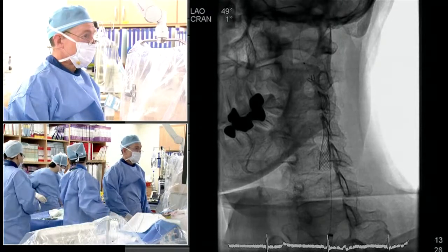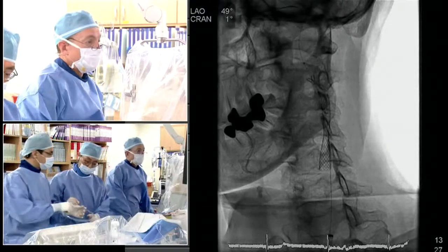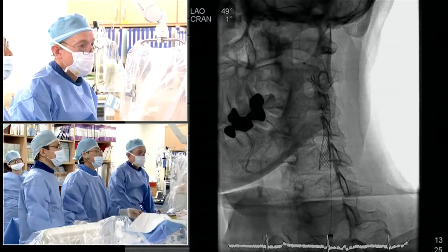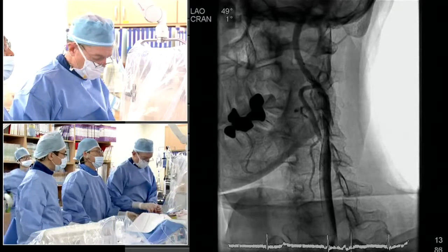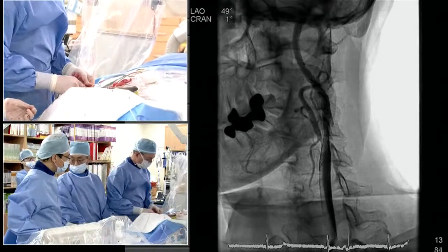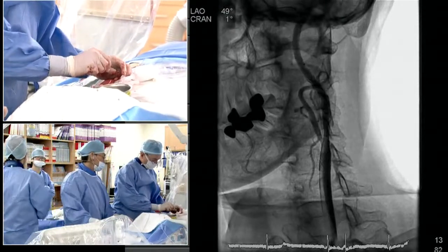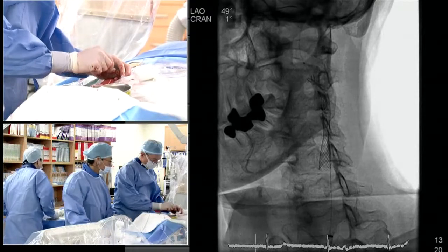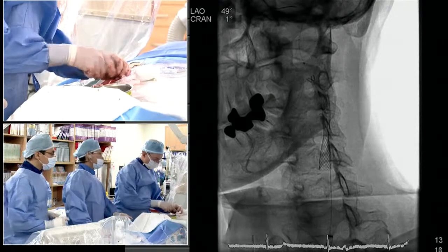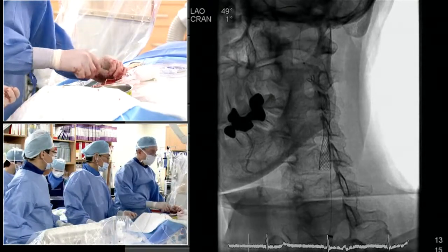So her pressure is still low. It's 100. Would any of you feel, and she's stable clinically, her heart rate is 52. Would any of you feel obligated to give her either atropine or to put her on a pressor at this point? Well, fluids for sure, but pressors probably not, or definitely not. Yeah, I'm quite comfortable not doing that.